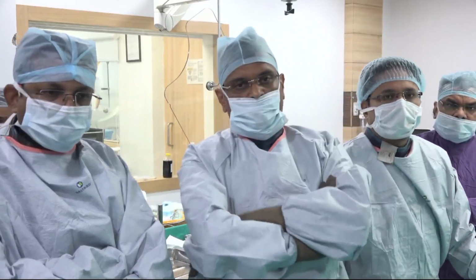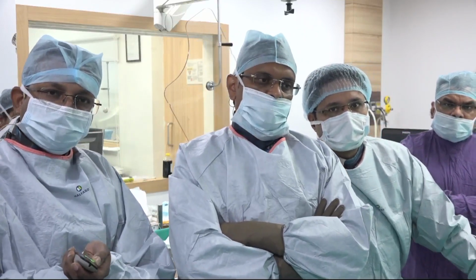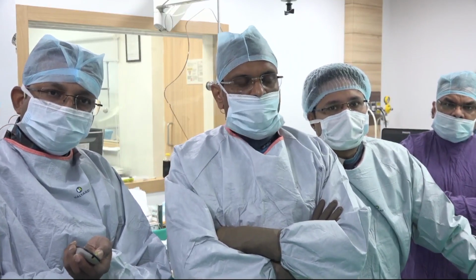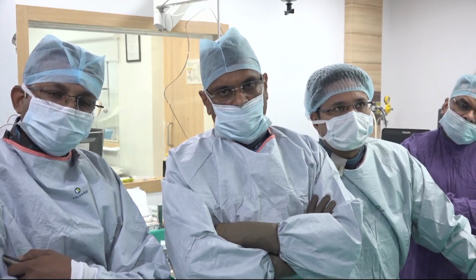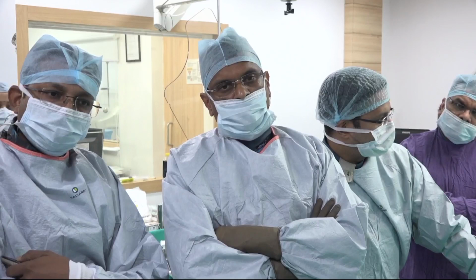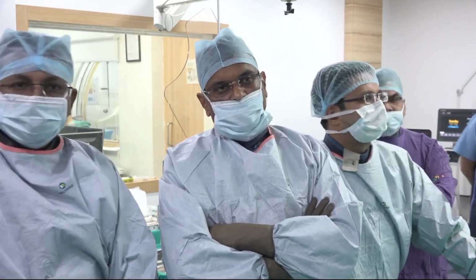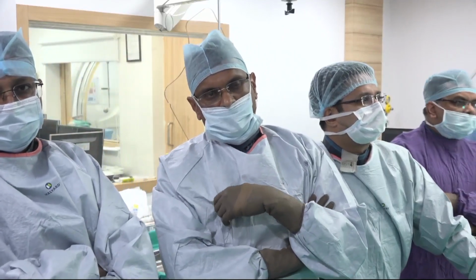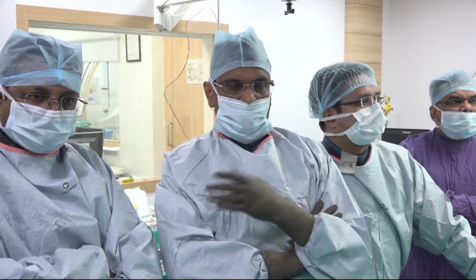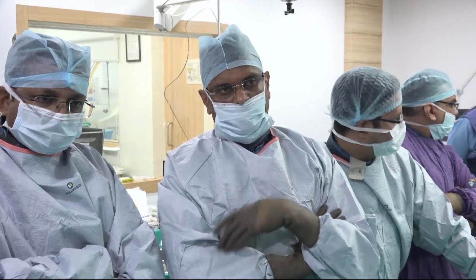This is a very hostile anatomy. We have a huge chunk of calcium on the annulus, and that chunk of calcium runs into the LVOT. So a balloon expandable valve is a big no-no in this case because of the amount of calcium as well as the calcium running into the LVOT. The reason is, if you expand a balloon, this calcium might just crack and cause an annular rupture. Dr. Gautam has already discussed that this valve has less chance of embolization. Though we are going to use a 34 millimeter valve, this is a self-expandable valve, so very little chance of annular rupture.